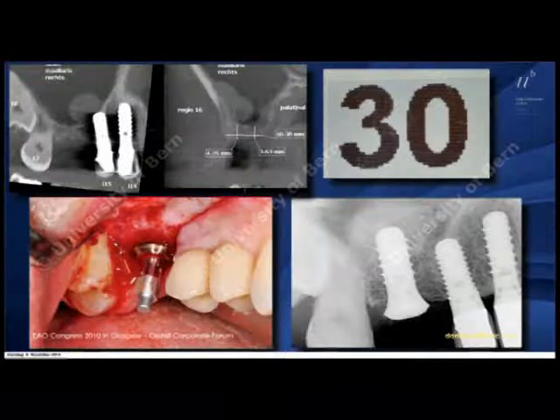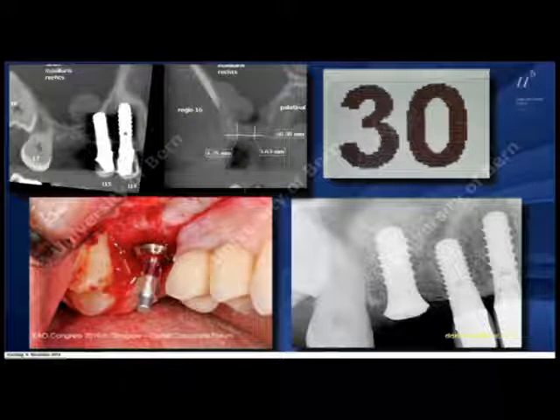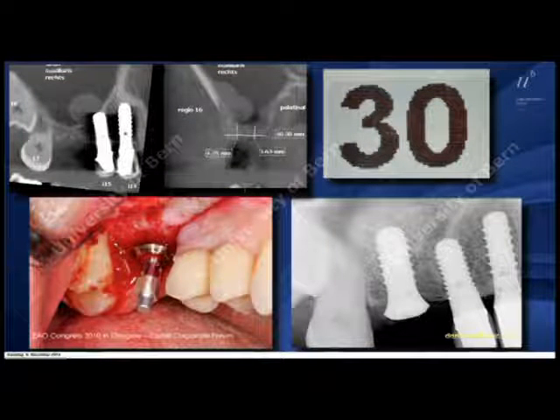Same day, on the other side, another patient. Actually, this is an orthopedic surgeon. He has been treated by a colleague. A little interesting finding here, and of course, not too much bone height in that area. You see a borderline case, 4.2 millimeter, but he's very busy. He's doing all these knee and hip surgeries. I normally see him at 7:30 in the morning before he goes to the operatory. And then we said, yeah, let's try to do it simultaneously, but we'll see.